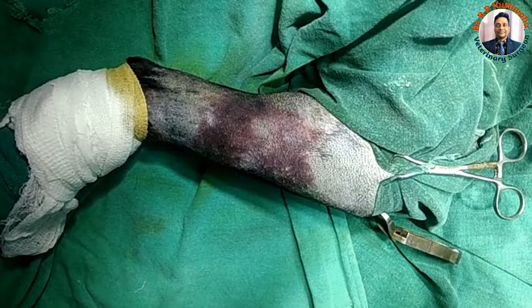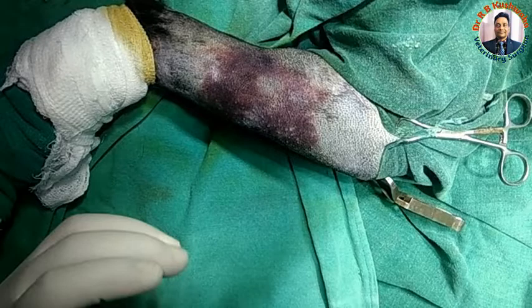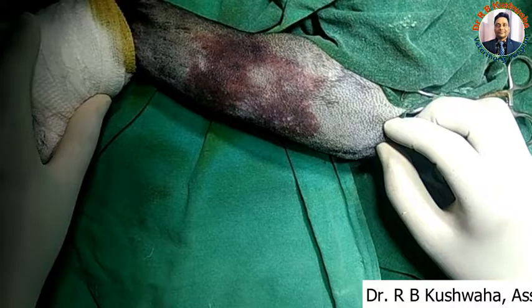Today we have a case of the mid-shaft tibial fracture. The fracture is a transverse fracture, and we have prepared this tibia for closed intramedullary nailing. Since the fracture is transverse and it is in the mid-diaphysis, I plan first to do the intramedullary nailing with closed reduction and antegrade pinning.